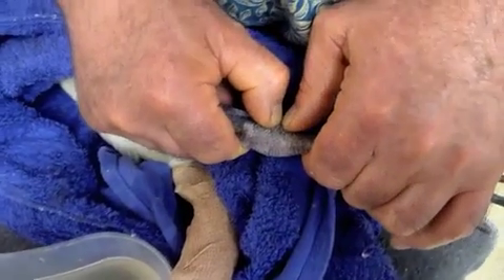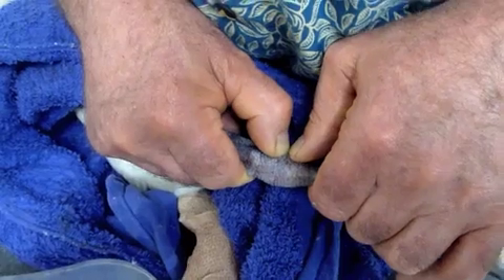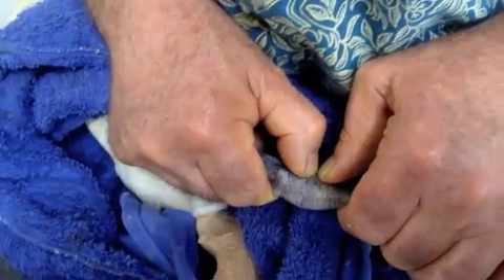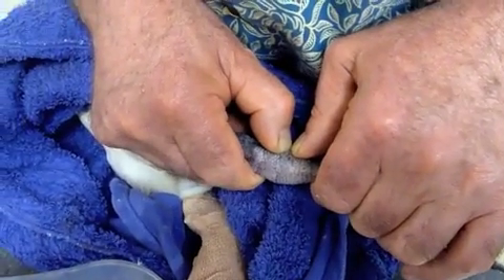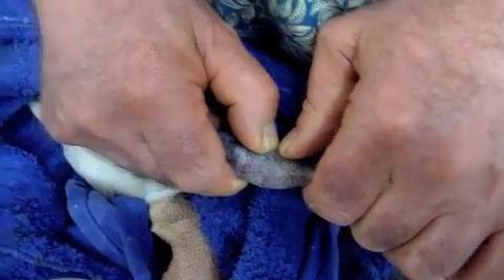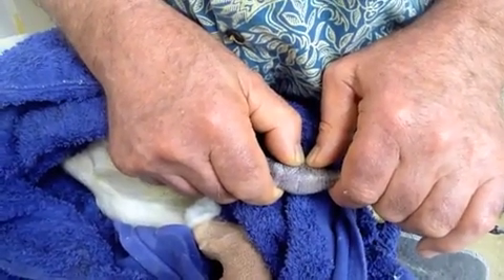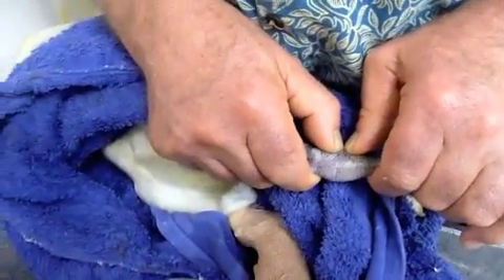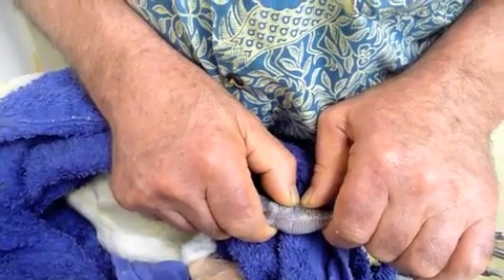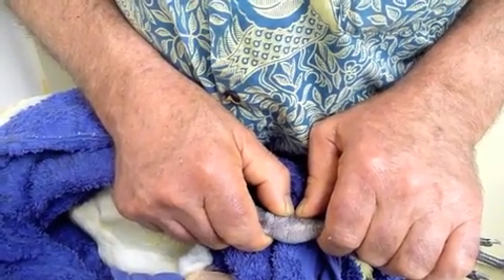Sing a song of sixpence, a pocket full of rye — so they weren't blackbirds that were baked in the pie. Basically, this is a game of patience. People who do this the first time tend to get impatient, and you can end up with compound fractures, which we aspire to avoid — it does happen, but if we can avoid it, it's better.